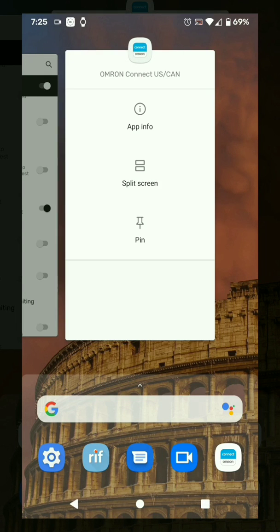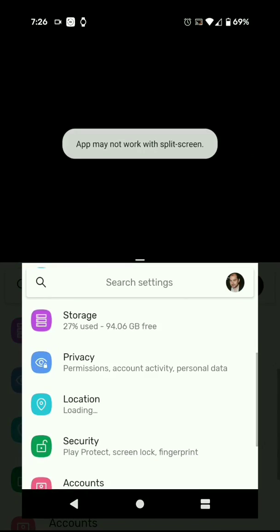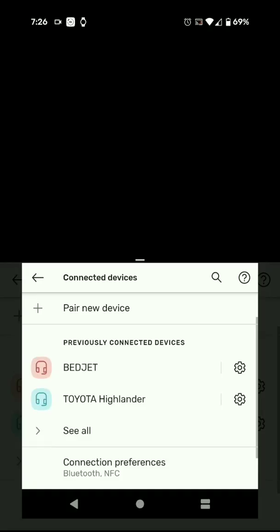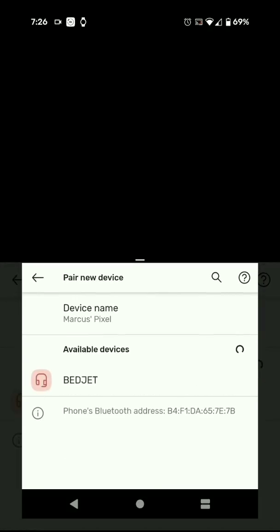I'm launching Omron, and you're not going to be able to see most of the screen because the app does not allow screenshots or video recording, but you'll be able to see parts of it in just a moment. Let me split-screen this and bring up the Bluetooth settings. I'm going to go into 'pair new device' just so we can see the Android system doing some scanning.